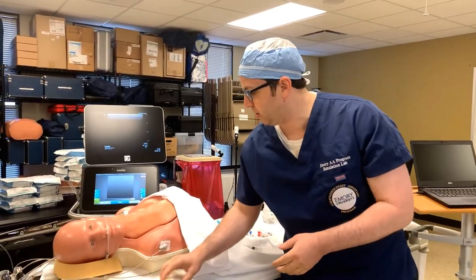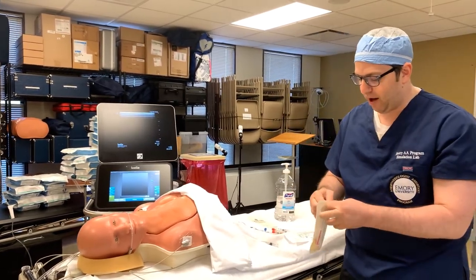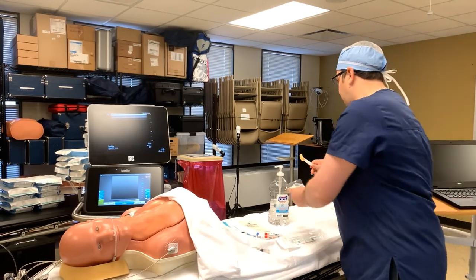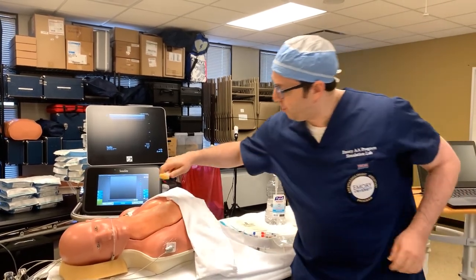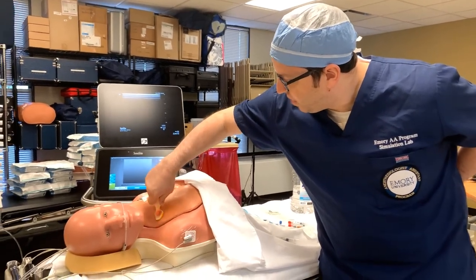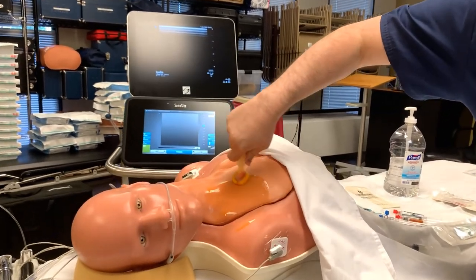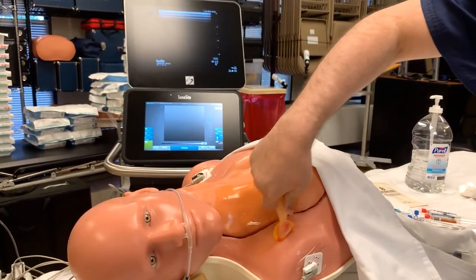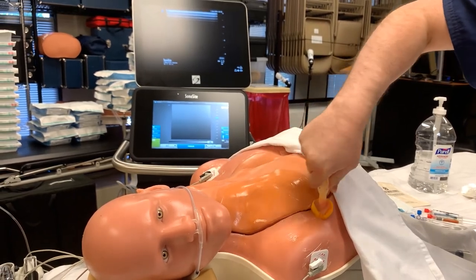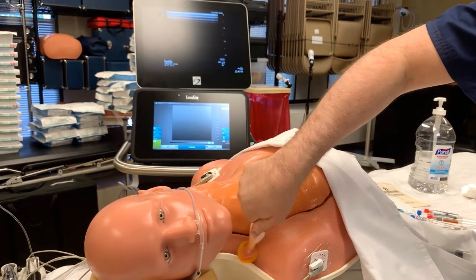Before I do that, the first thing I'm going to do is prep the patient, so we'll allow for adequate time for the prep to dry while we're getting the rest of our equipment ready. After I prep the patient, we'll run through all the equipment. We're going to start in the center with a nice wide prep — this is going to be for an interscalene block. We'll prep this nice wide area and it's all going to be draped out in just a few minutes.